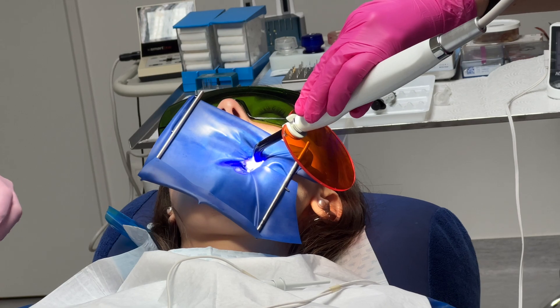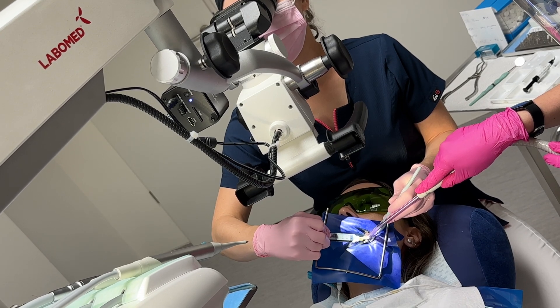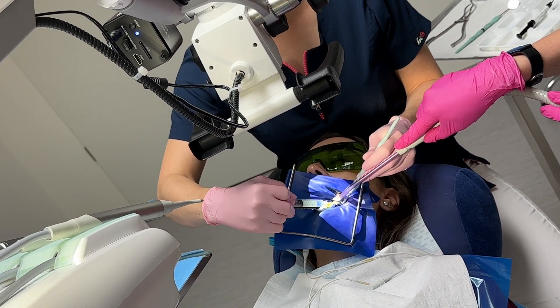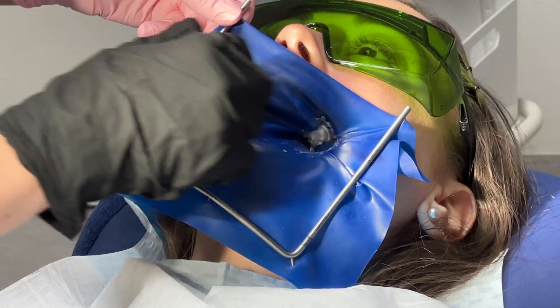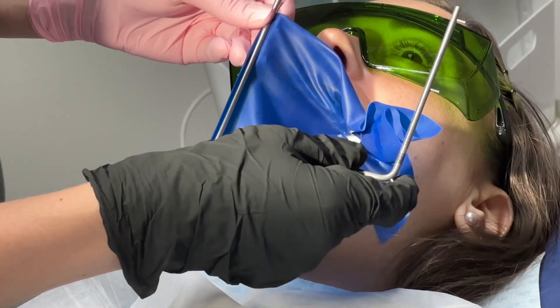In dentistry, use of a rubber dam is sometimes referred to as isolation or moisture control. This is important because it significantly improves the outcome of many dental therapies.